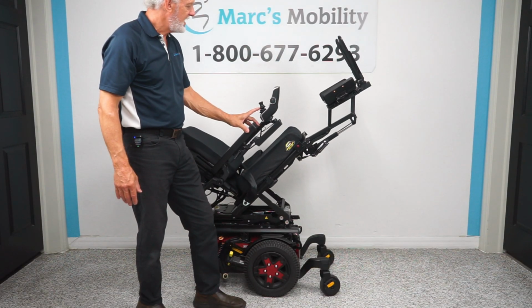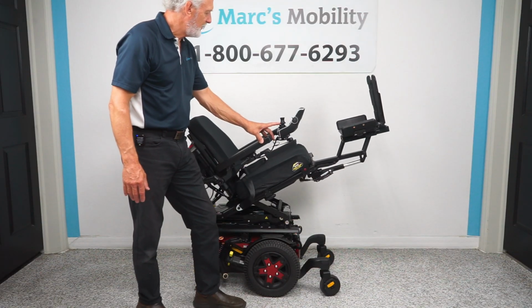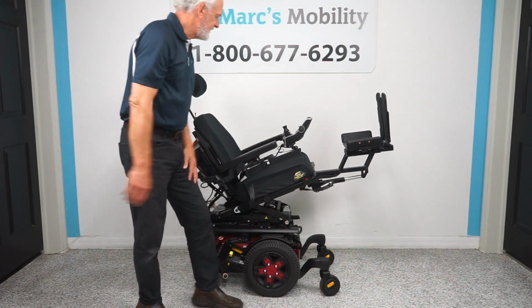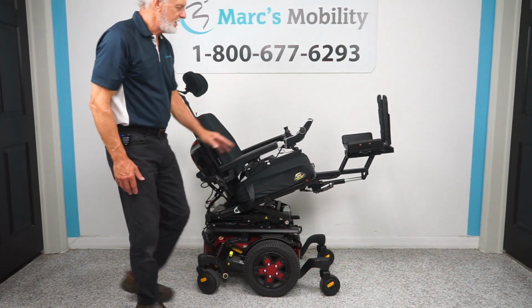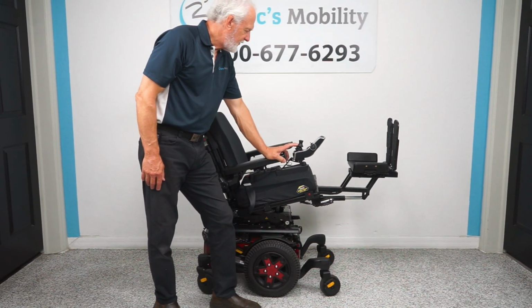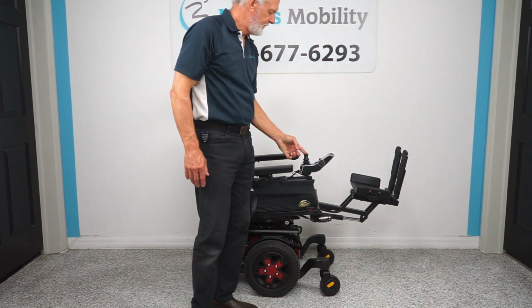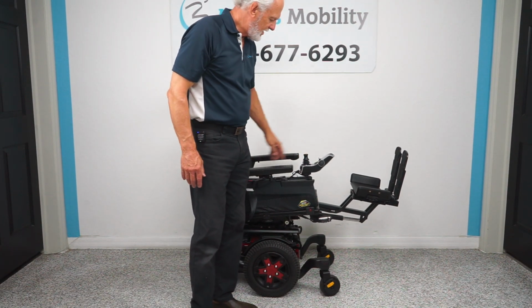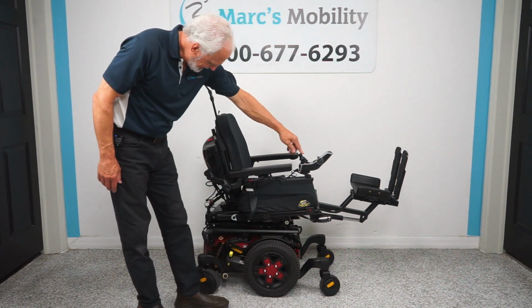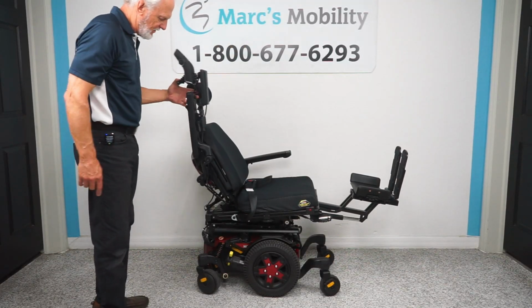Let's bring the seat down. Even if you're halfway up in the air, your feet right now would still be above your body, above your heart, okay? All right, the last function is called the electric recline. So the electric recline is the back right here going back by itself. So if you look at it, I'm going to raise the arm so you can see this. See the back is going back by itself.